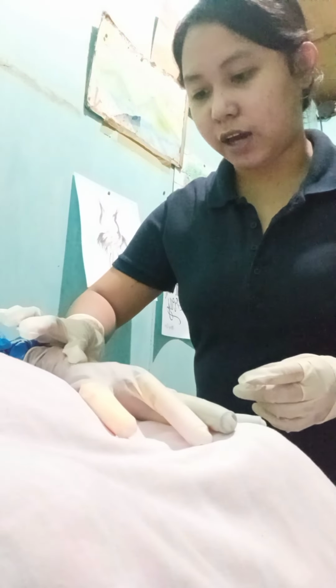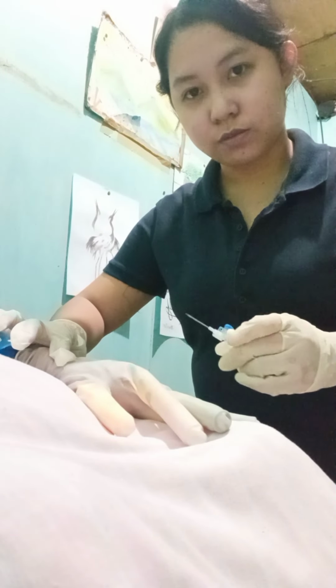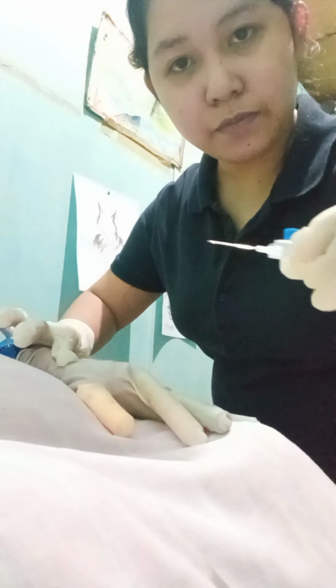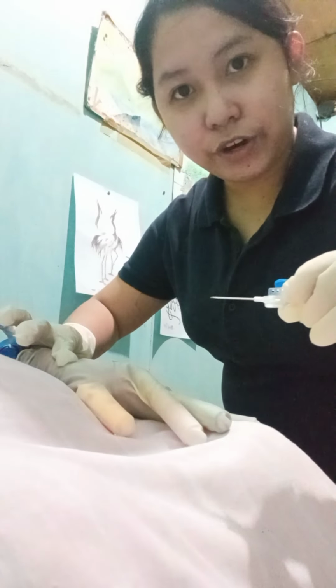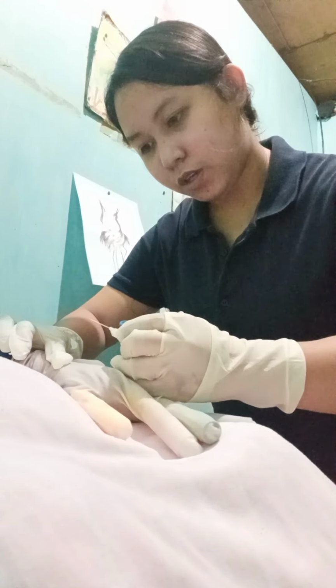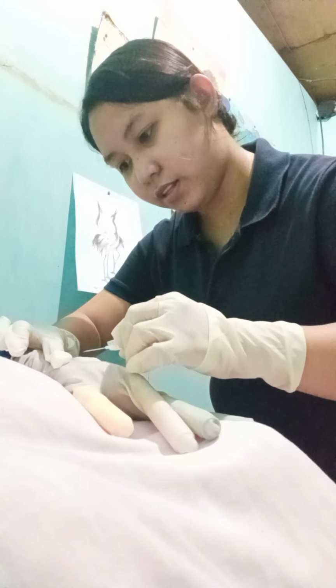Hold skin taut. When you're inserting a needle, make sure that the bevel is up to avoid injuries to the vein. Stretch the skin. Position your needle at a 15 to 30 degree angle.